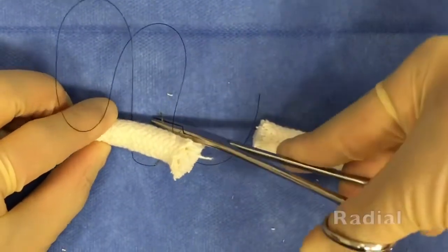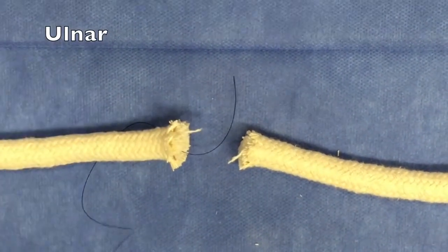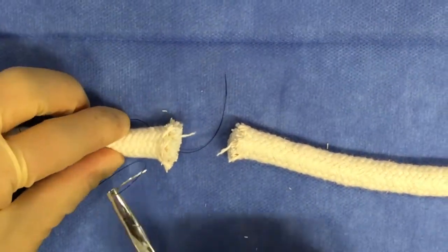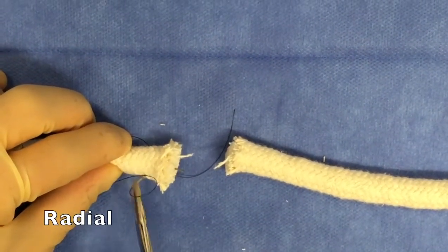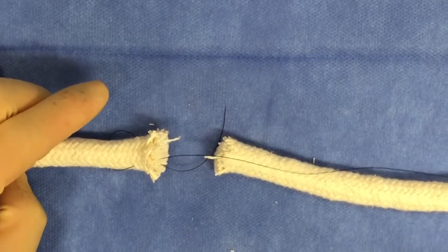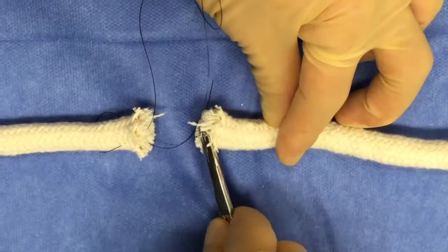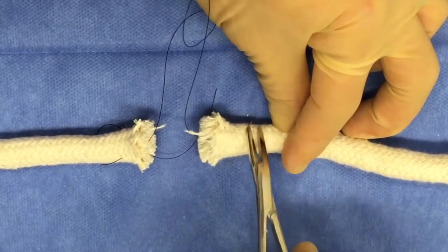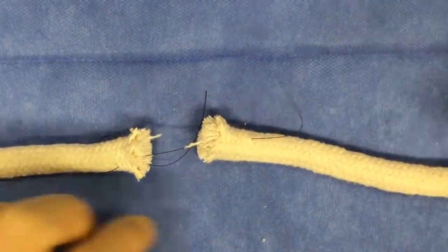You're now going to pass from the cut edge into the tendon itself, exiting more on the ulnar side of the tendon. You'll then pass the suture behind the tendon, or as we showed in the previous variation, suture through the ventral aspect of the tendon itself. And this time you're going to enter on the dorsal part of the tendon more to the radial side of the tendon. But this time, instead of continuing on to the radial side of the other cut end of the tendon, you're going to make a type of X shape and cross back over to the ulnar side of the other side of the tendon as you enter through the cut edge and exit through the dorsal surface of the tendon. This is going to help achieve our figure of 8 pattern.